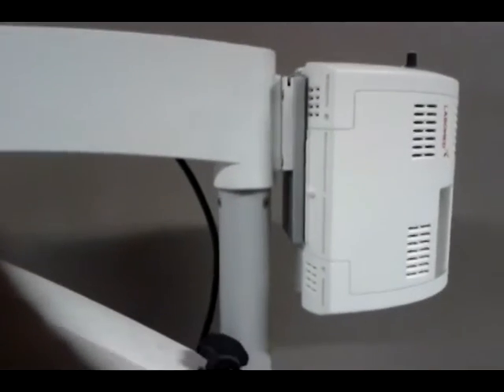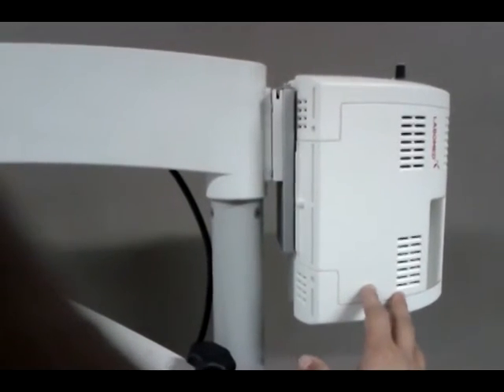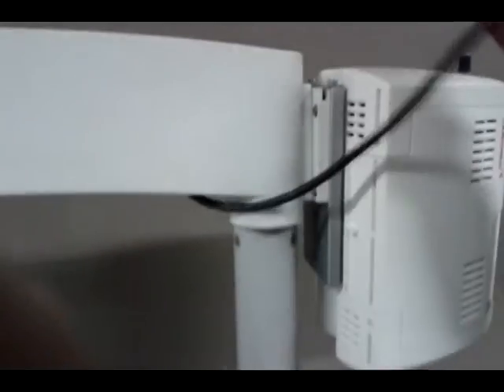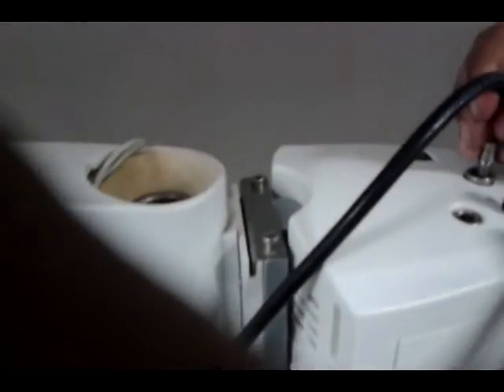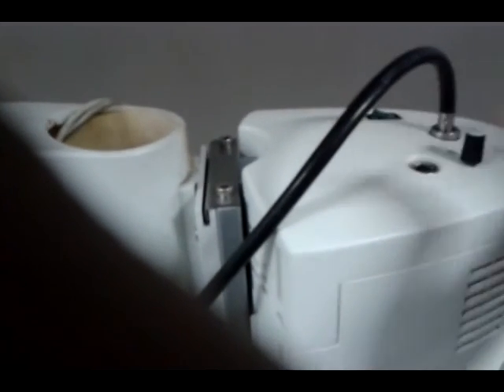The power supply is properly installed on the Zeiss microscope. Now insert the fiber optic cable on the above situated light guide.